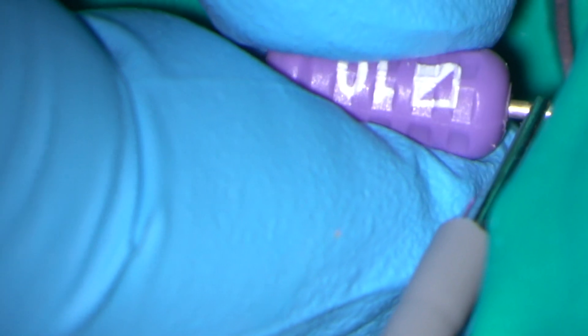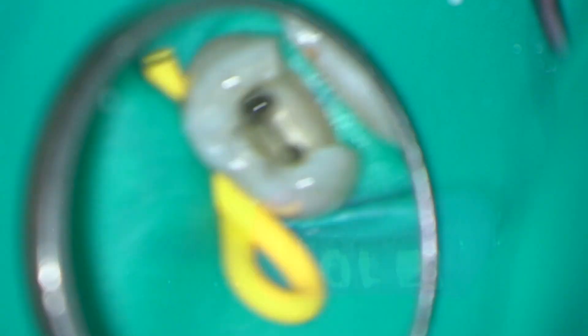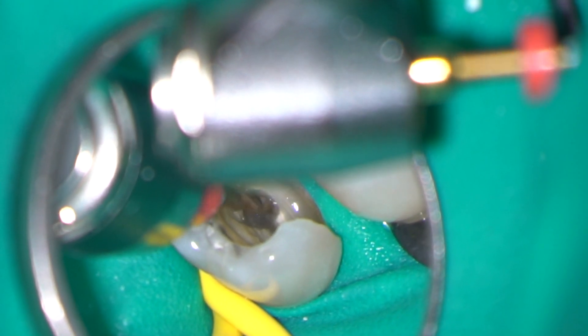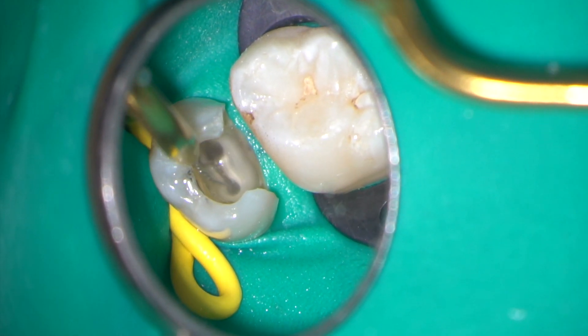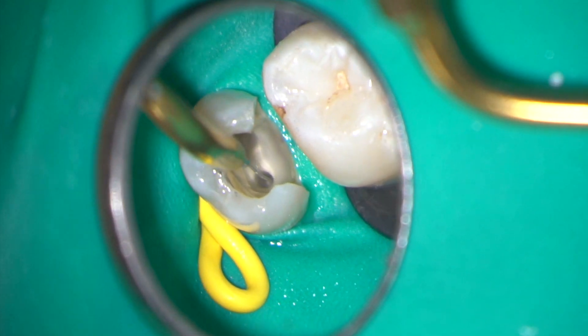It's back to the electronic apex locator to confirm the working length of the distobuccal canal. The canal was prepared with the Wave 1 Gold Primary Instrument. Irrigation was carried out with 3% sodium hypochlorite and an Irrisafe ultrasonic tip.